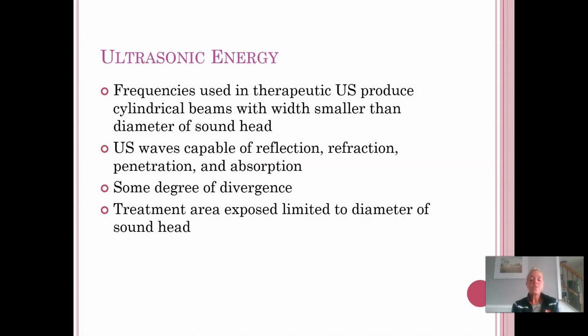So the ultrasound that's produced by the ultrasound head, again, we're going to have the energy coming straight out of the head down into the tissue. It's actually not produced by the entire head. The majority of the sound waves are going to be emitted from the center of the head, and as you get closer out to the periphery, you're going to have less and less ultrasound energy coming from that area.